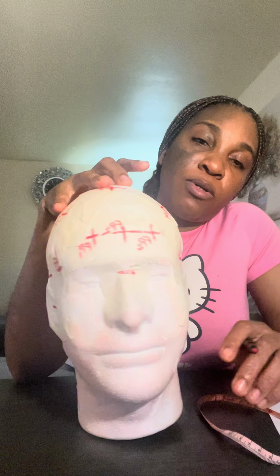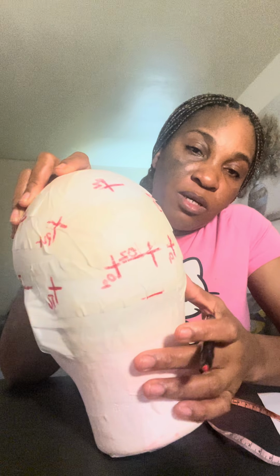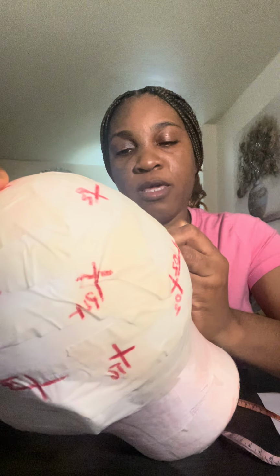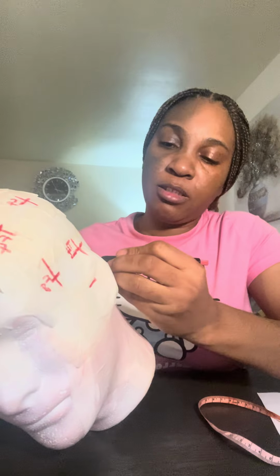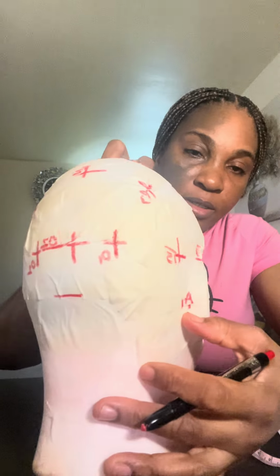Now the next one is my A1 and A2, which is located at the mastoid. So this is my A1 and this is my A2. Okay, A2 and A1.